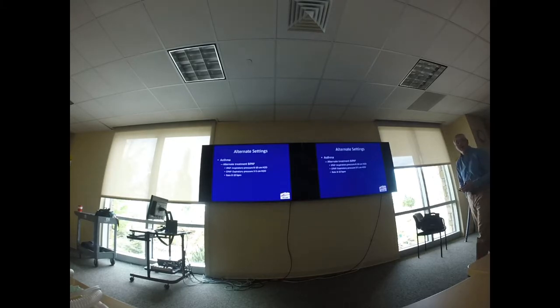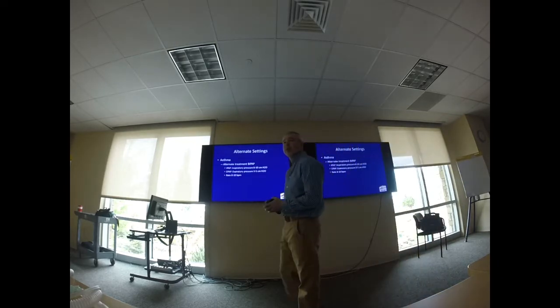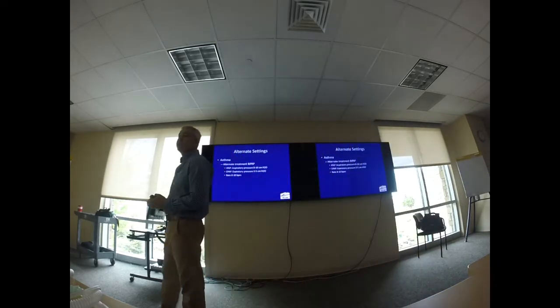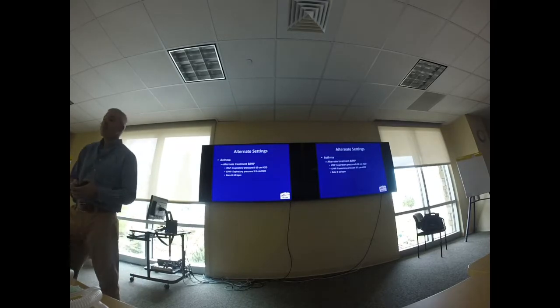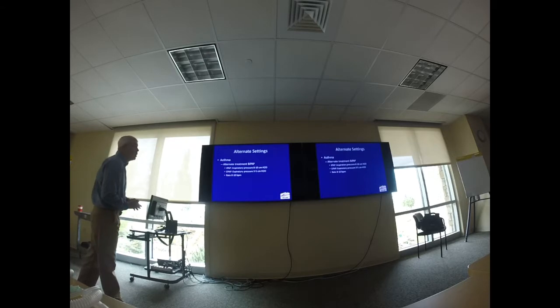Or what? For obstructive pulmonary disease? Yeah. Is that what he was saying? Tell me again, say again, brother, I'm sorry. Well, in initially setting up, say you don't have vent settings to go off of, just dropping that PEEP to make it easier because you're trying to promote exhalation. Exhalation. Obstruction.